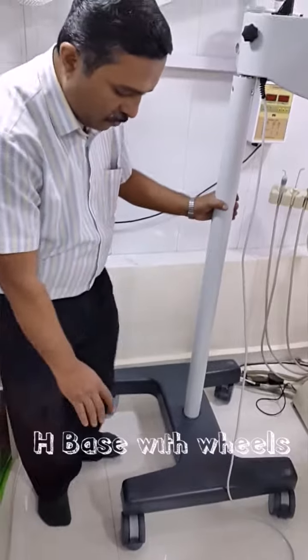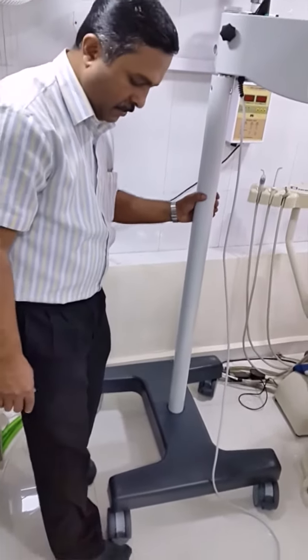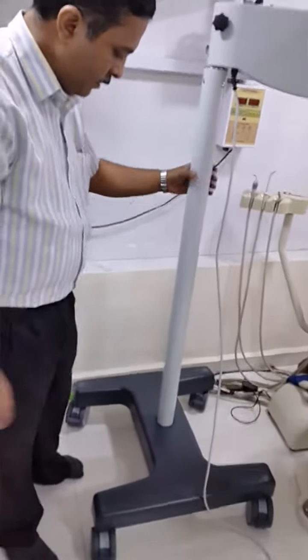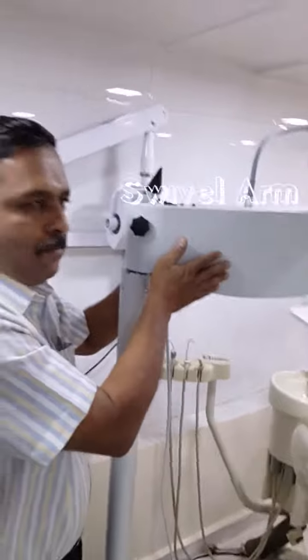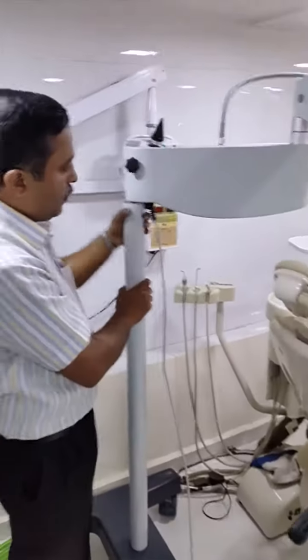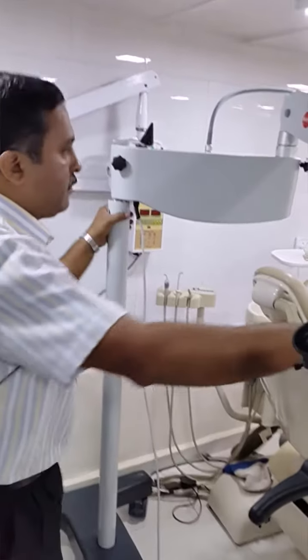This is the base. The base is rollable. You can lock the base with a lockable piece. Then this is the column. This is called a swivel arm. The swivel arm has got rotation around the column and it can be locked with this mechanism.